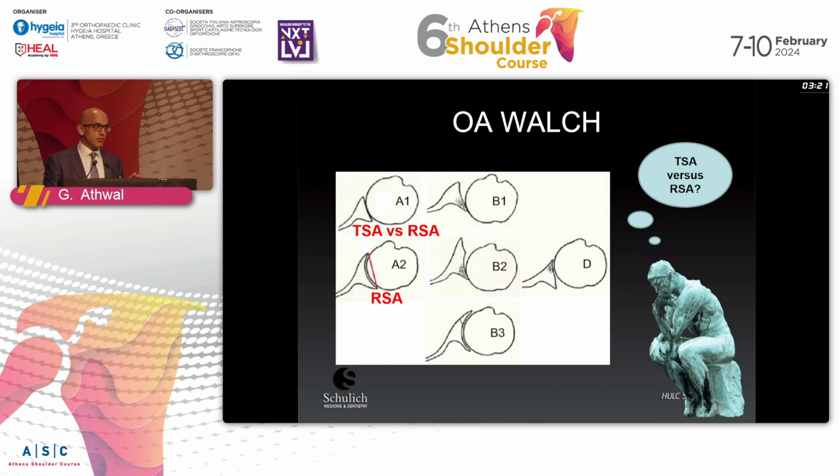The A2 for me is a reverse. If they have medialization, I'm not going to address that with an anatomic. Those patients get a reverse.